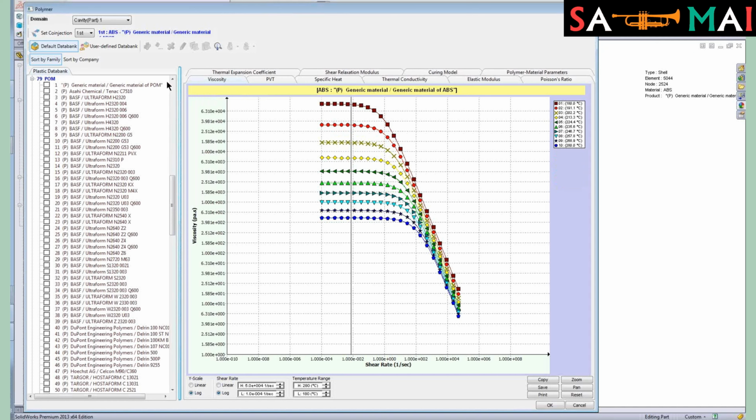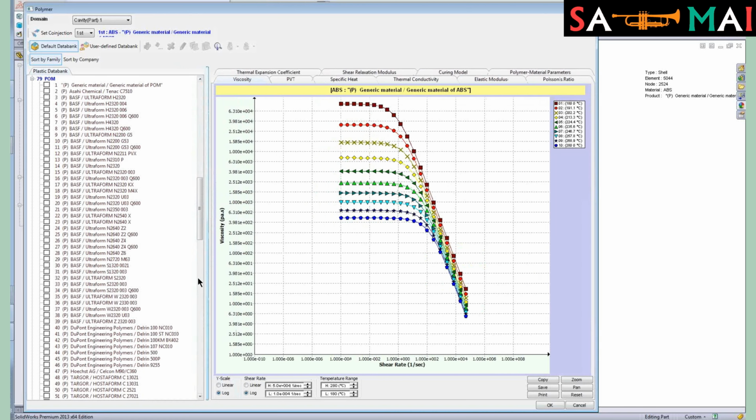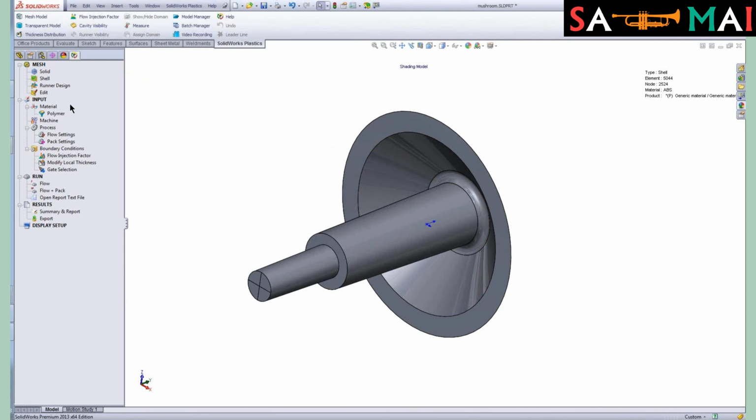For the Plastics Professional product, you just have the database available. And for Plastics Premium, you have the capability of creating your own materials. So let me go ahead and cancel that and show you another function here. Since I've already used the particular resin for this part, there's a list. If I just right-click on the polymer, it's always available to me for recently used polymers. So we'll go ahead and assign Delrin 500 to this.